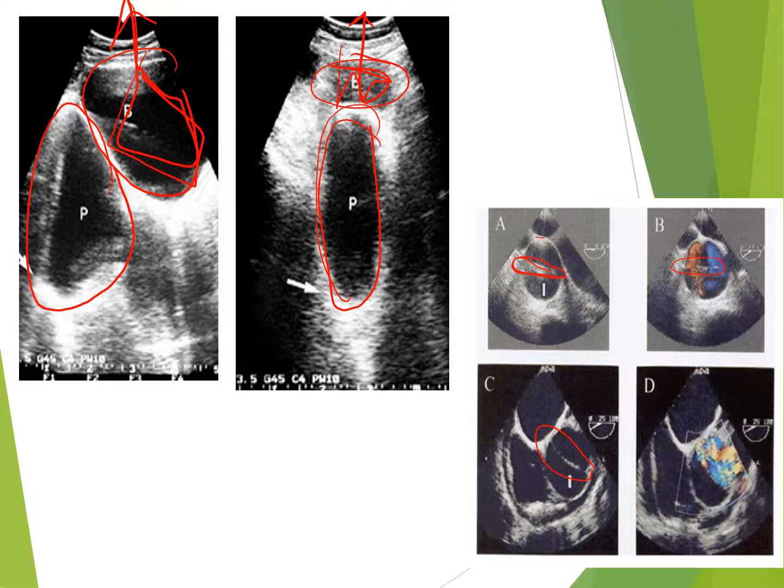In this case, in the second picture on the bottom here, this is a true intimal flap, and so we can see that proved with color, and therefore this is actually quite an emergency. We've got to get that patient to surgery. Where in this case, if we call this an intimal flap, they got him to surgery and nothing was in there, you'd have a lot of people pretty mad at you. So we have to be very careful with our artifacts and that they don't cause incorrect diagnosis.